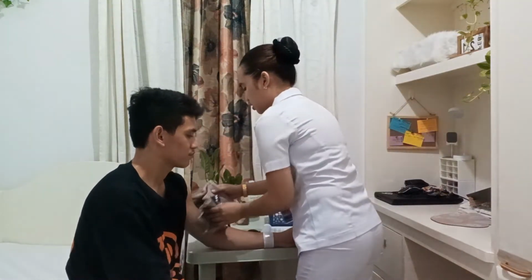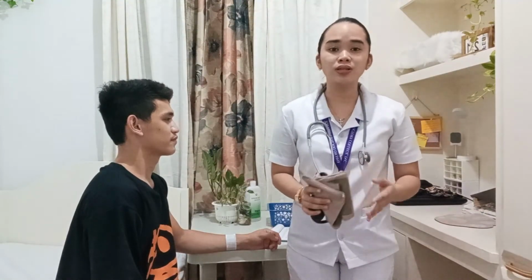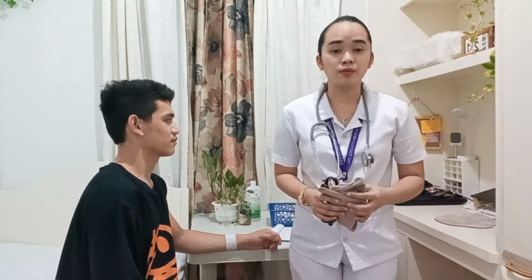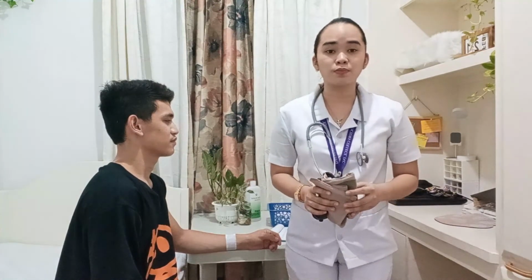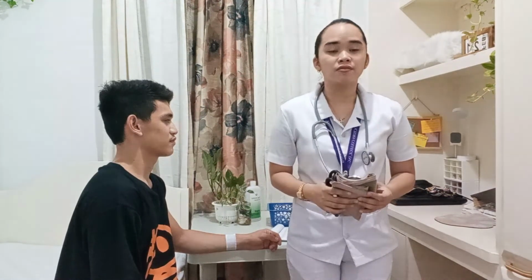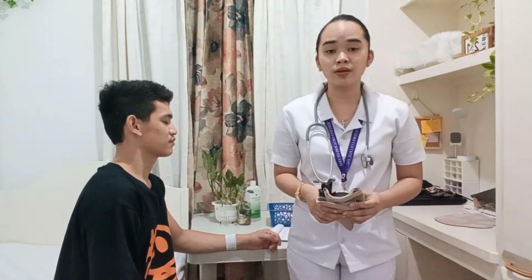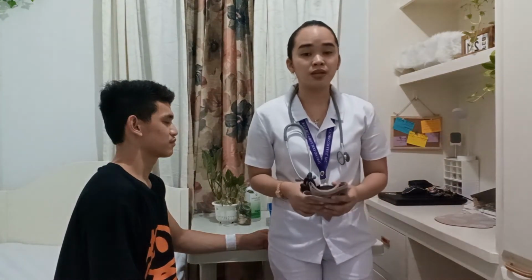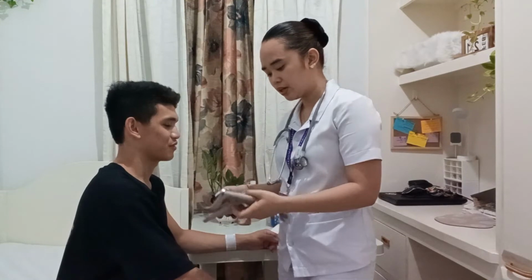Now I'm going to remove this sphygmomanometer. Now we are going to wait for about 1 to 2 minutes before making further measurement to permit the trapped blood in the vein to be released. Also, we can repeat the above steps to confirm the accuracy of the reading, especially if it falls outside the normal range. If there is greater than 5 millimeters of mercury difference between the two readings, additional measurement may be taken. And also, since this is the initial examination of my patient, I'm going to do the procedure again on his right or his other arm. Okay?